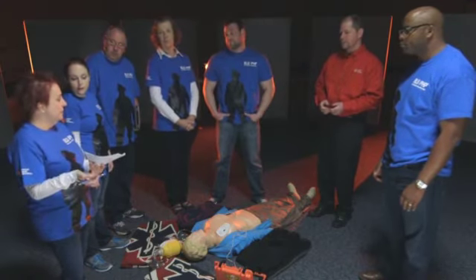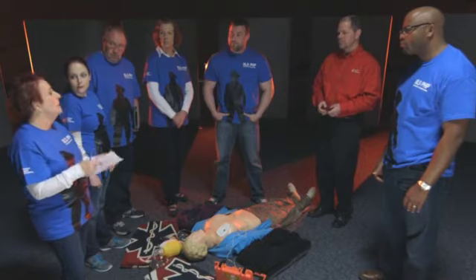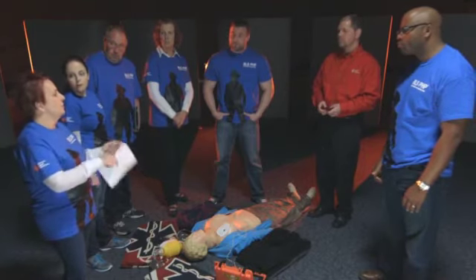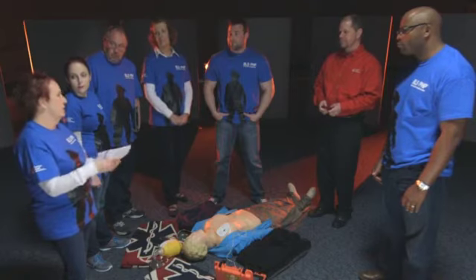Deb reflects: we had a bystander doing CPR on a 65-year-old female with sudden collapse, hands-only for four minutes. The four-person and two-person teams arrived and quickly assessed and began compressions. The team did a great job minimizing interruptions, hovering over the chest while waiting to analyze, then starting immediately after charging and shocking. The AED allowed compressions during charging. The team minimized rescuer fatigue well — as soon as one got tired, another took over, which is indicative of good systems of care and teamwork.